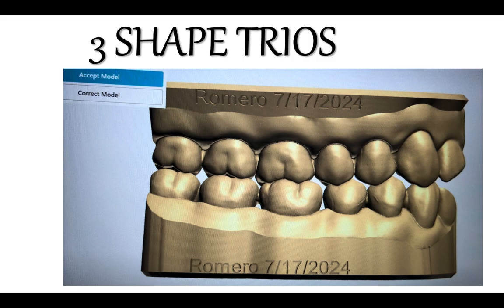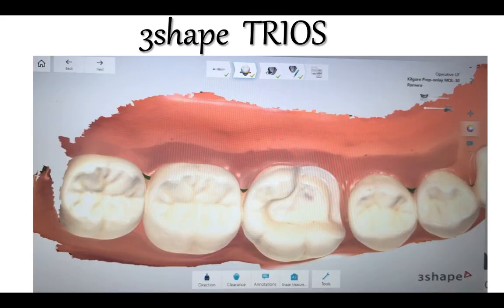Well, this was created with 3Shape. You scan and then automatically you do this base, automatically you mount it as a bite, and automatically you can play with it in 3D. I'm not going to do it today because you have already seen this model before, and the idea is that you know a little bit more about digital dentistry at UF.